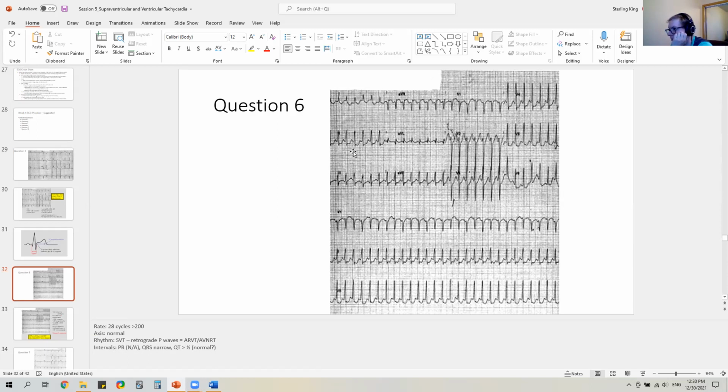Hypertrophies. It's going to be tricky to read any atrial, so I'm just going to skip atrial, because I could look for it, but if it's got that bypass tract spinning, it's going to be almost impossible to use our criteria because it's already abnormal. And then ventricular: this looks like left ventricular because we look at this one, 1, 2, 3 about, and this is huge. Look at this, this is like 1, 2, 3, 4, 5, 6. That's well past what we need, providing I'm reading the graph right. So I think it's a left ventricular hypertrophy.